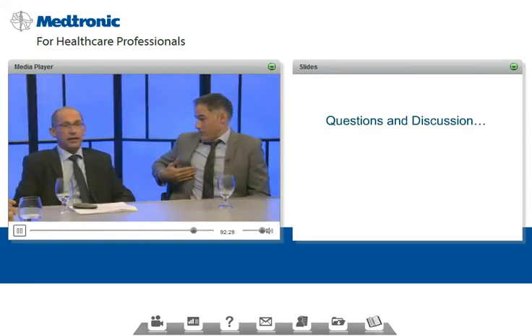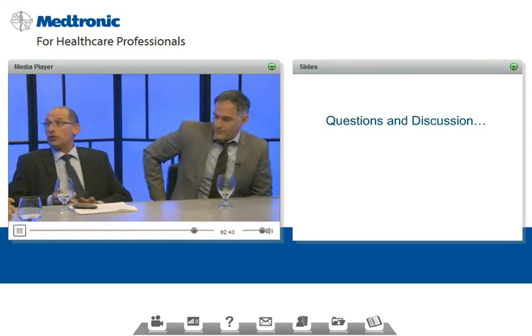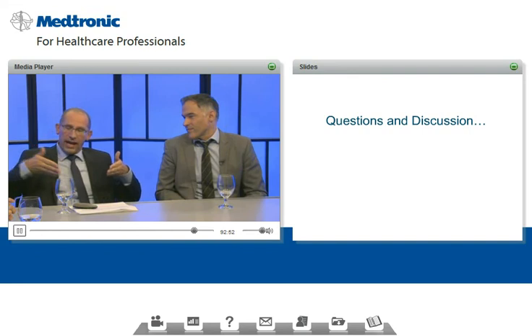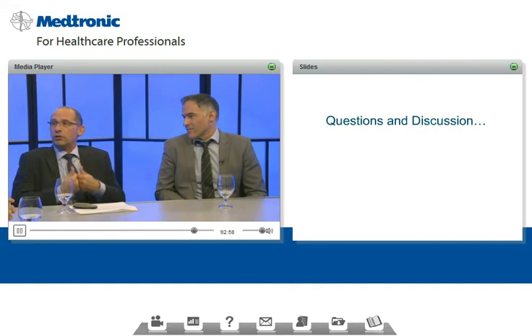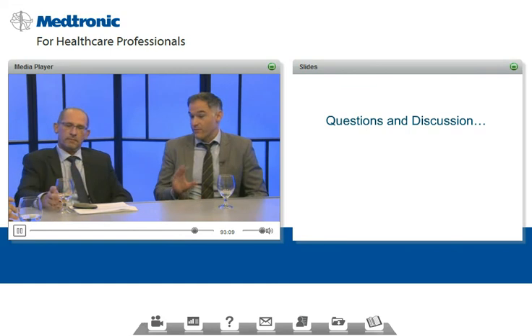Yeah. I'll answer this quickly. I do not know how to treat a patient who does not download. I don't know how to approach them. So we take care that all our patients, before they come to any one of our staff, if it's the physician, the nurse, the educator, the dietitian, everybody downloads in a specific place. And then when she comes to the office, we all access this from the server of the hospital, and we all look at the downloads as part of our daily routine care of our patients. So actually, I guess I've already answered this question, that we emphasize that in our clinics, even if it's a physician visit.